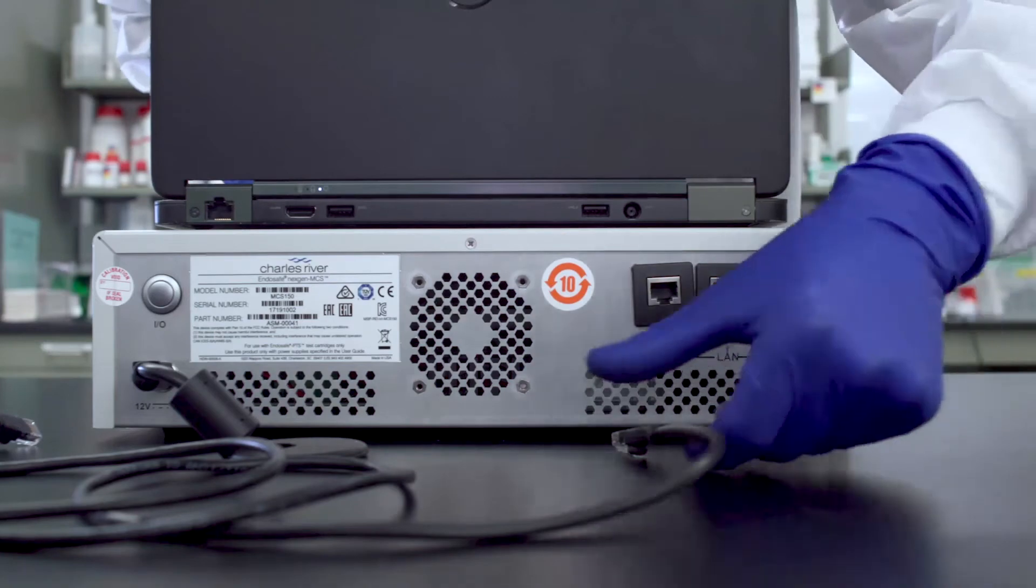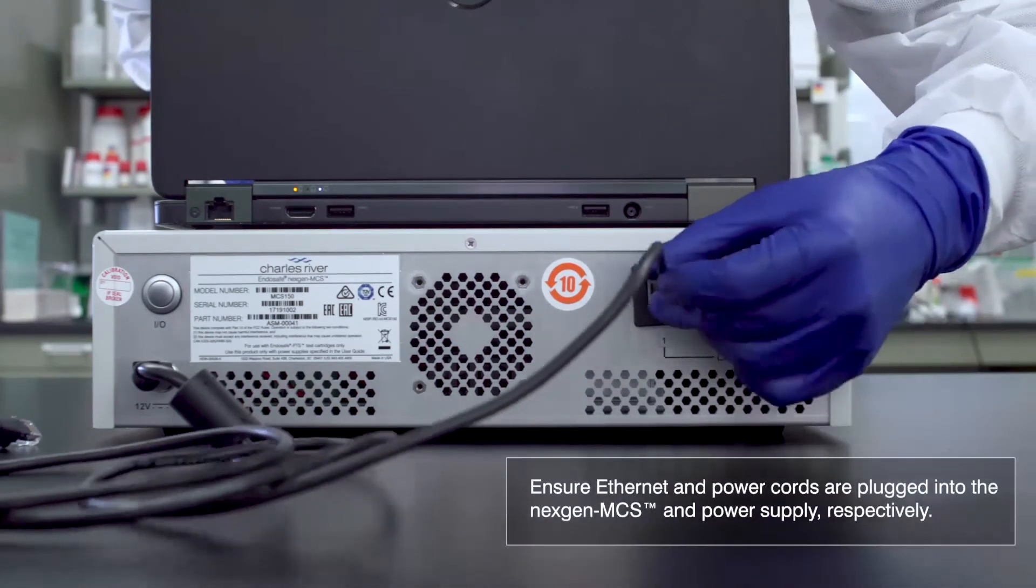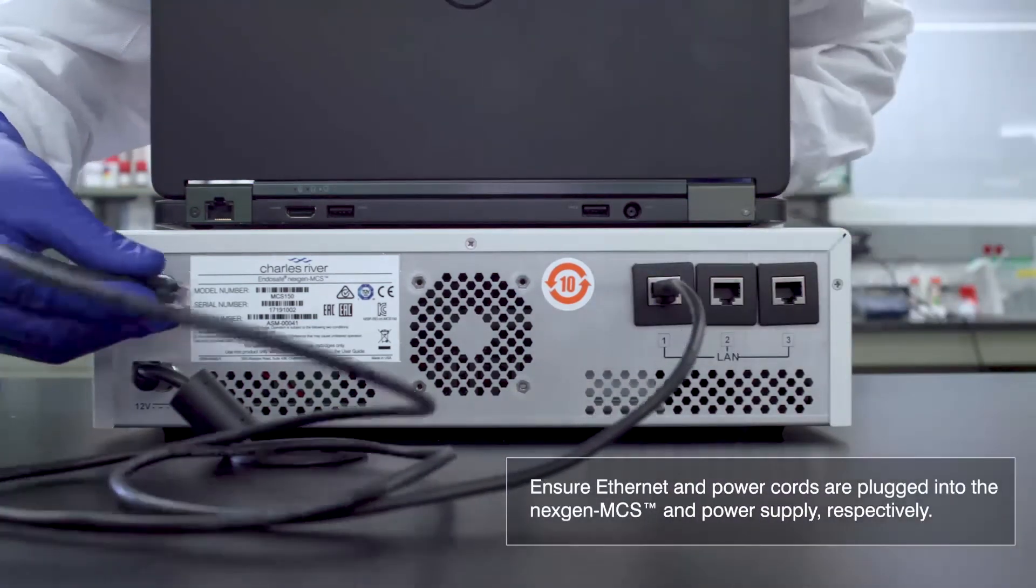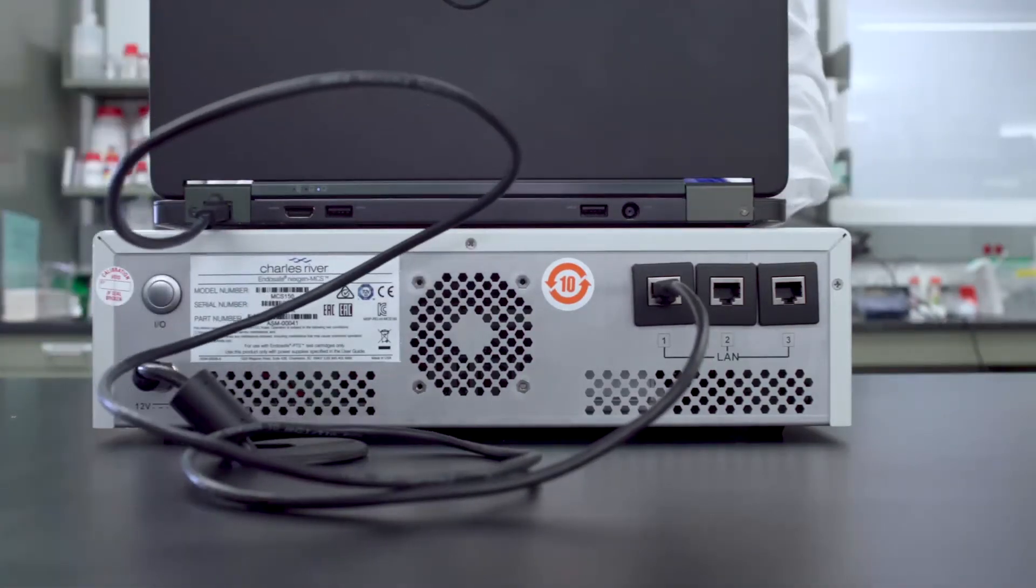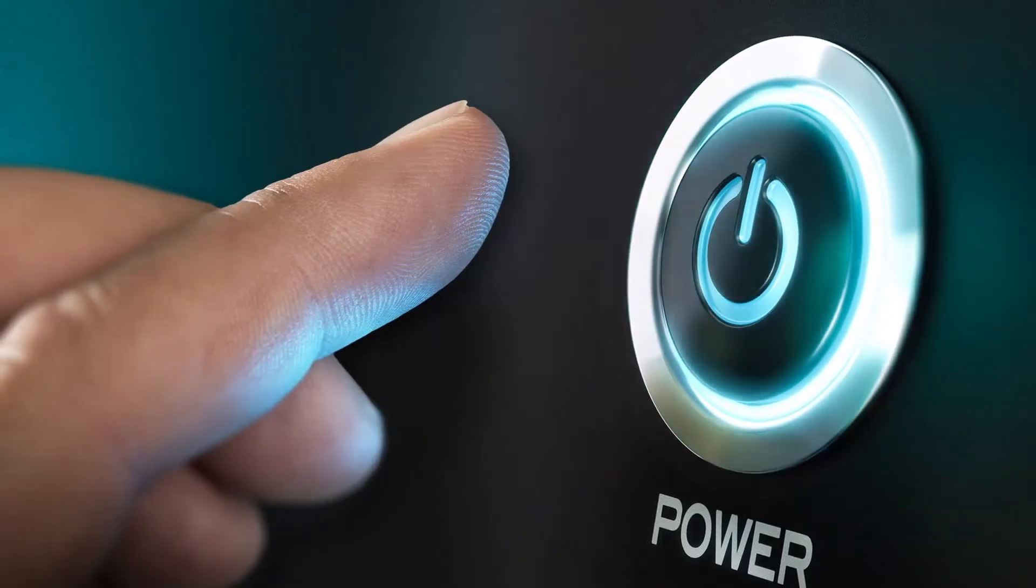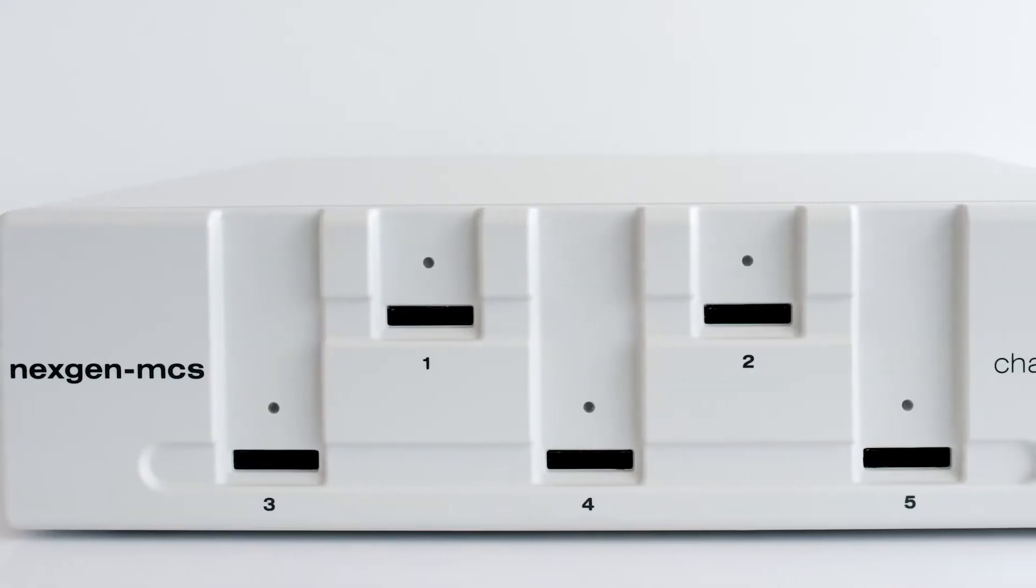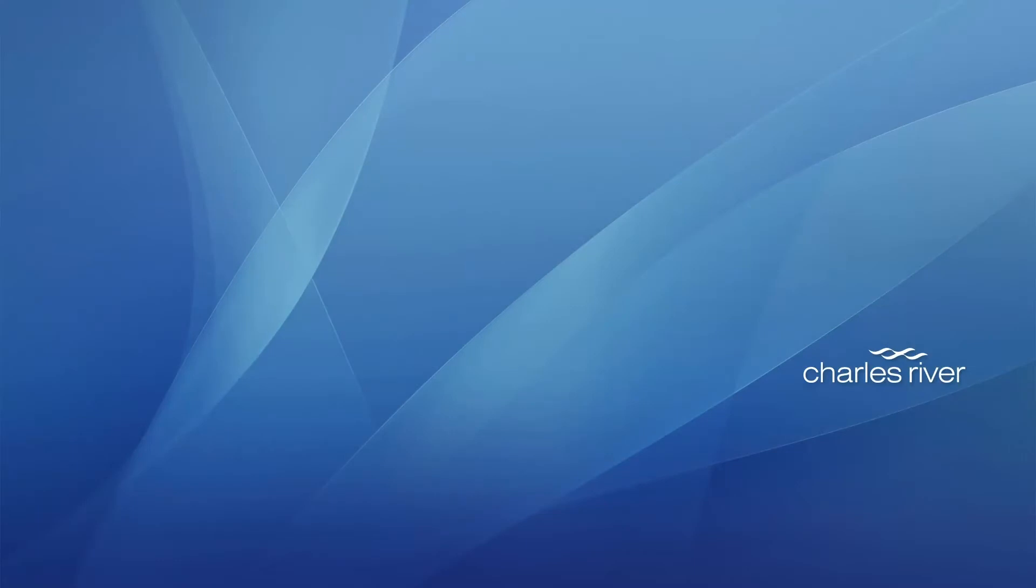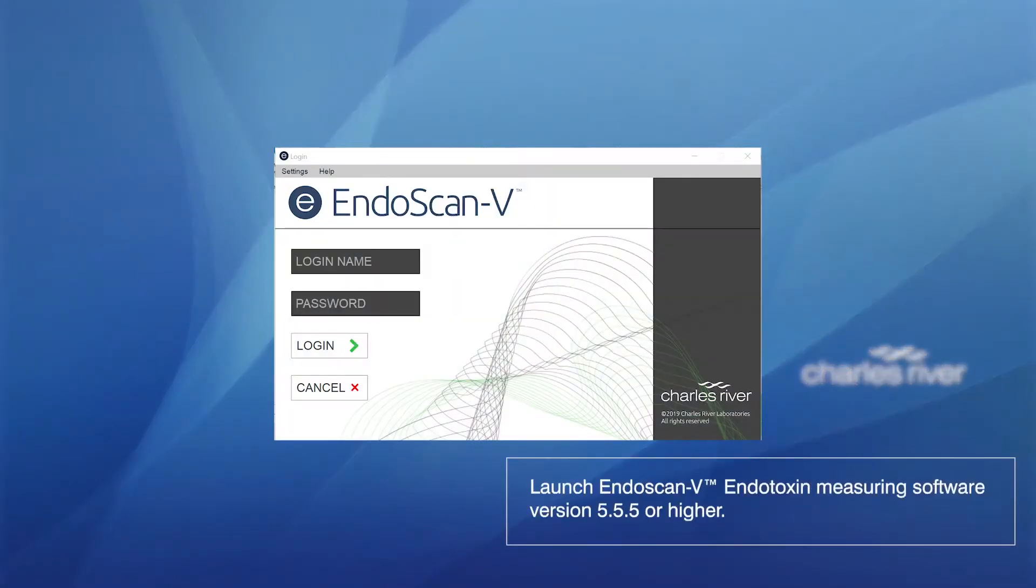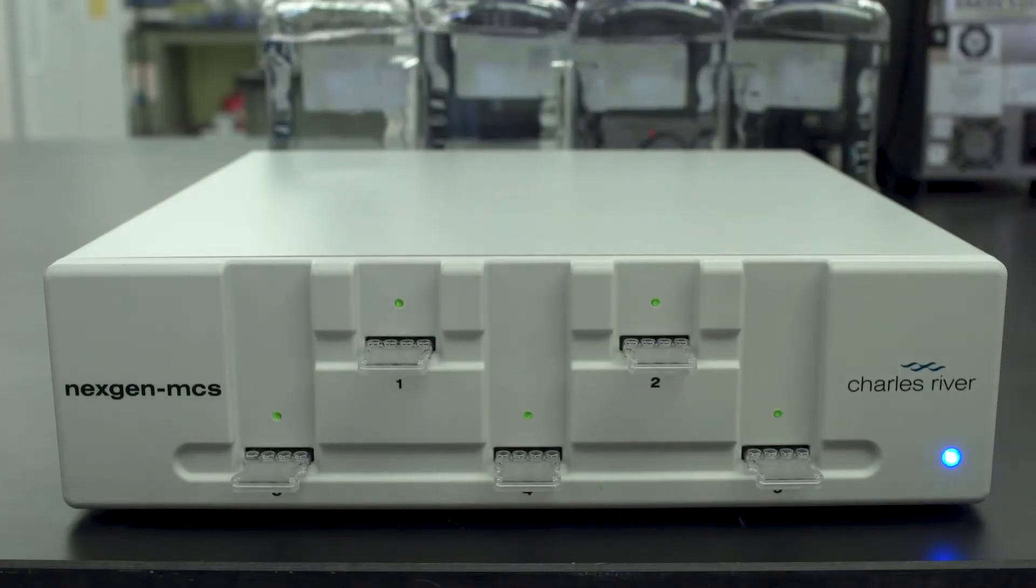In order to begin your testing, you will need to ensure Ethernet and power cords are plugged into the NextGen MCS and power supply, respectively. Once powered on, the LEDs over the bays will illuminate to green. Turn on your computer and launch EndoScan-V, endotoxin measuring software, version 5.5.5 or higher.